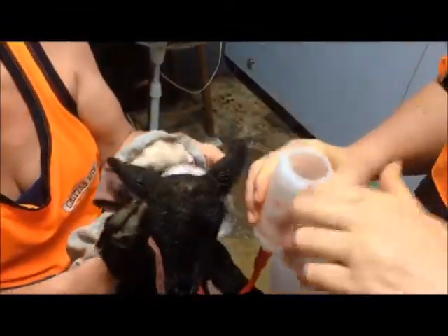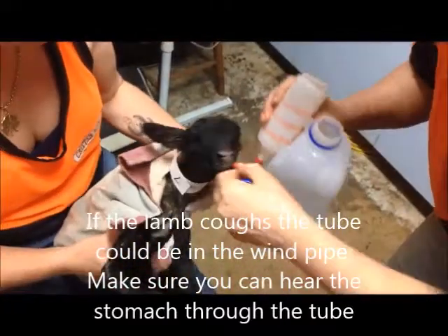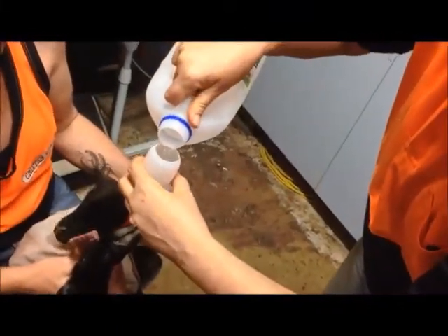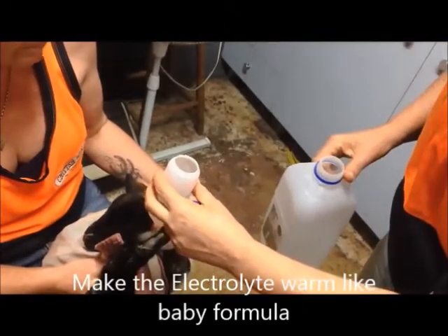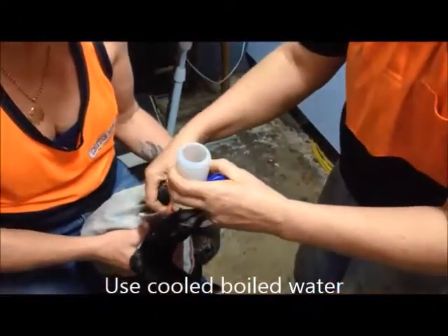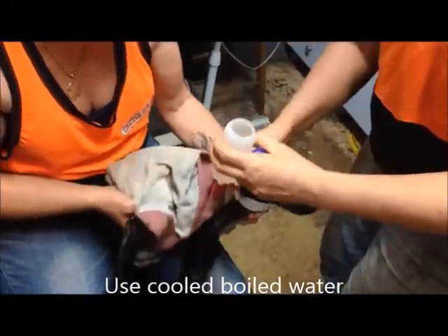Now what we're going to do is just pour this in — let him rest on your arm. We just pour this in. It's not forceful, so it only lets as much electrolyte into his stomach as he's got room for. So it won't hurt him or rupture his stomach or anything like that. This is what we did to the two lambs in the previous video — they were both dummy lambs.